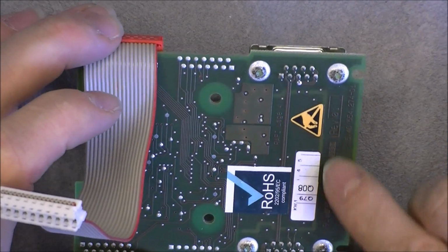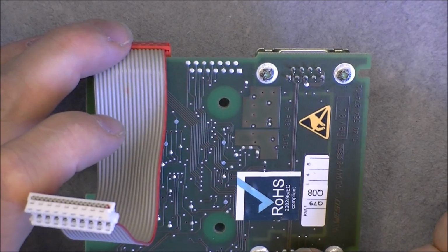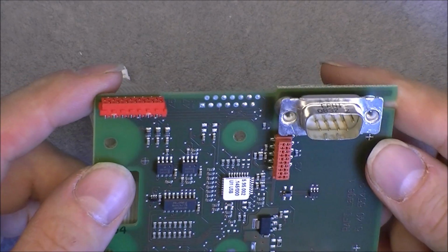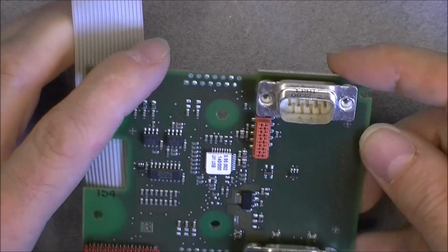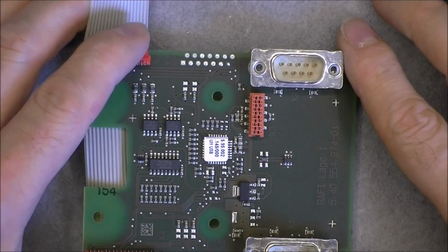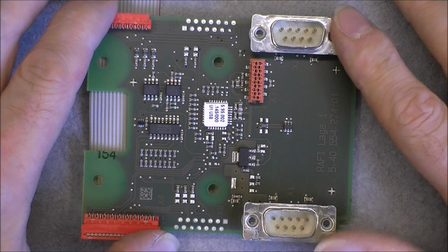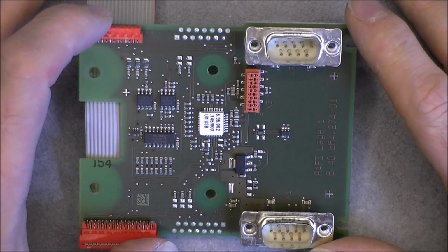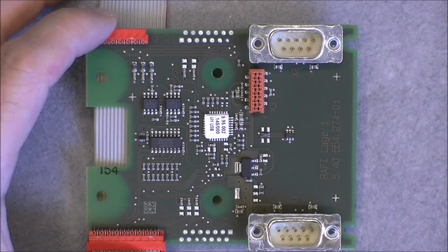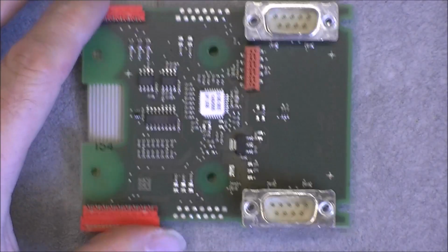Okay, so I see a big power ground plane inside the PCB. I see little tracks here which might be the data tracks, or these ones. Okay, so figuring out the pin out should not be too difficult with the multimeter. At least if I can first figure the power supply pins and then try to find the data lines. After this I do not know if it will be recognized as a regular mouse or anything, but it will be interesting to play with for sure.